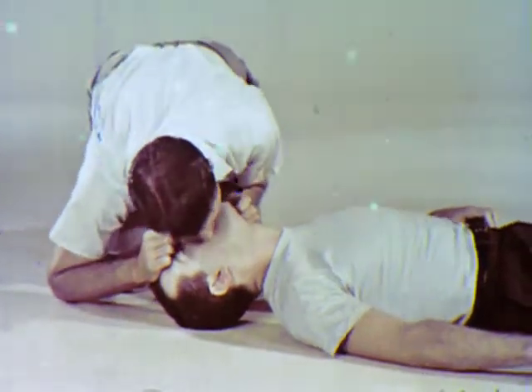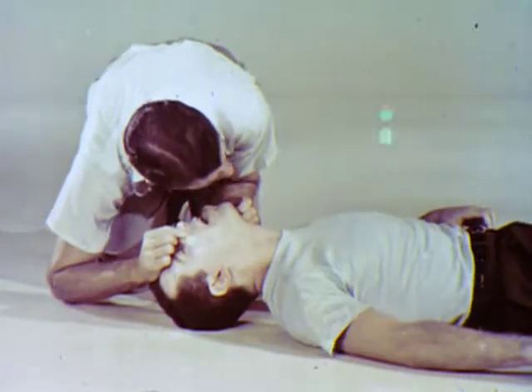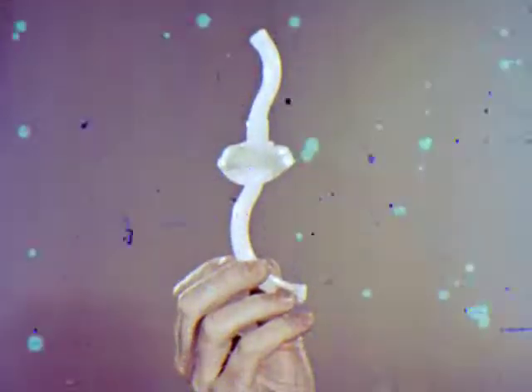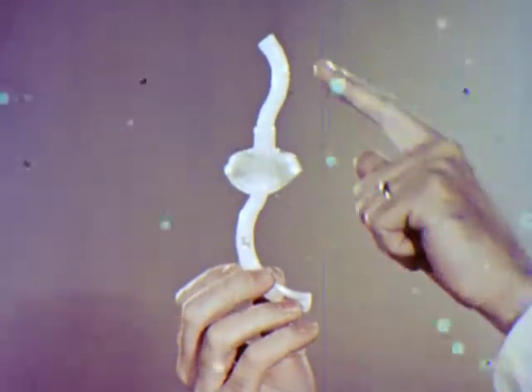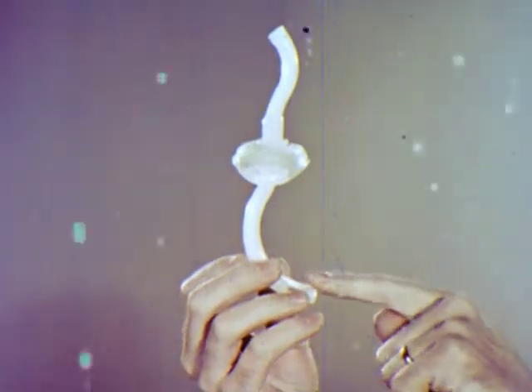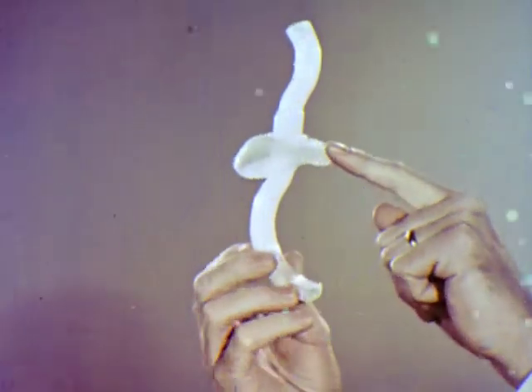Direct mouth-to-mouth breathing is effective because it gets adequate amounts of air into the victim's lungs and is always available. However, as a result of experiments conducted at the Department of Anesthesiology, Baltimore City Hospitals, under the auspices of the Surgeon General, United States Army, a device called the resuscit tube airway was developed. It is made of plastic. It provides a mouthpiece for the rescuer, a breathing tube for the victim, and a flange to prevent air leakage.